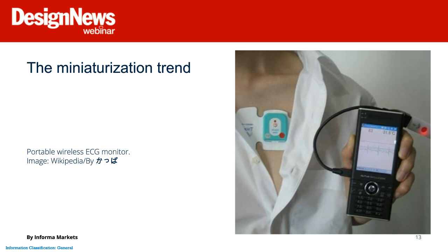But now we move on to the more portable type of cardiac monitoring, and this is today and going forward. Wireless units like this one can send the electrocardiogram to a wearable monitor or even to a smartphone, which is what we're showing here. I believe we're now seeing TV commercials that are showing phone apps with that kind of capability. And they can record events that could occur during activity, which obviously a cart-based unit can't do. You can't run with a cart-based electrocardiogram next to you.